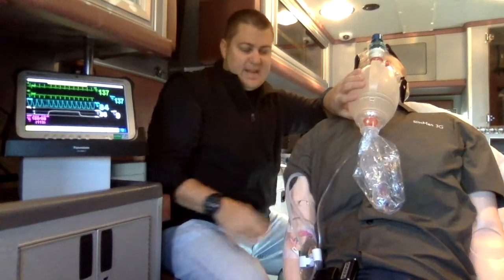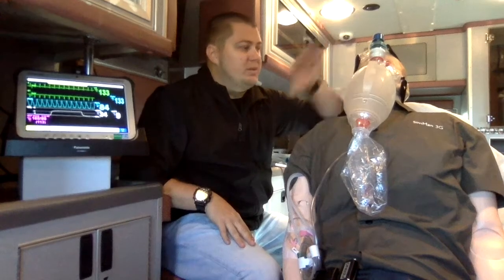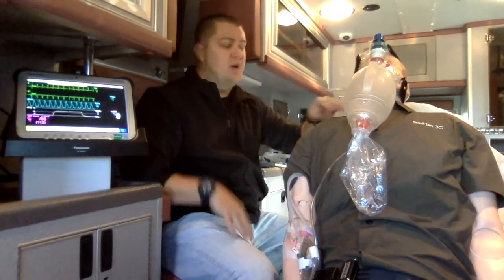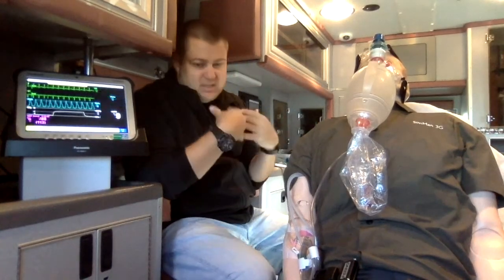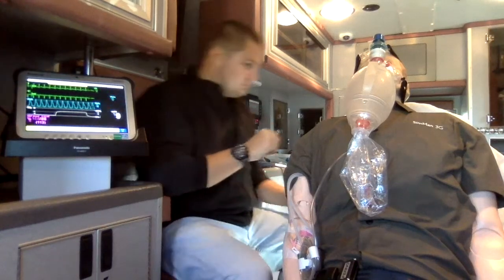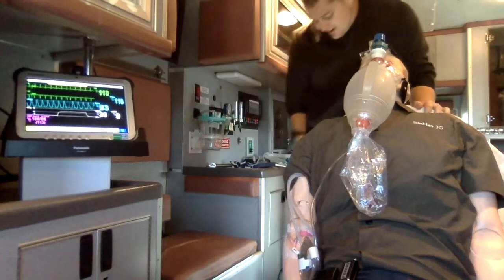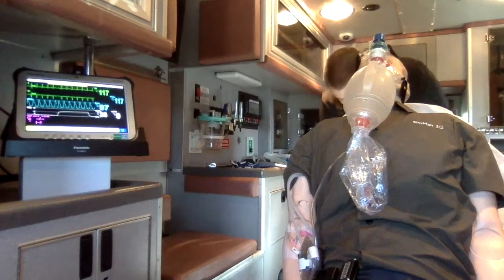IV's been established. I'm going to have my partner ventilate him at the rate I described with this current technique, keeping the CPAP mask in place. It is secured, there's no air leaks, and it also frees up my hands. So I'm going to draw up my paralytics because my suspicion is I'm going to need to eventually get a secure airway on this individual. So we'll ventilate for a while. I'll get my supplies all ready, get medication drawn up, and then we'll do one more set of vital checks.